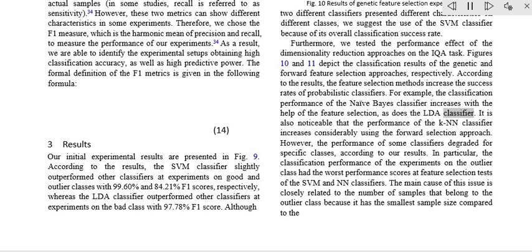Each image includes red dots that represent our OD and fovea detection results. Moreover, the EROD boundaries are presented in each image with red lines. Given that our approach depends on an accurate OD position, any image transformation related to the OD position will have a negative impact on our results. For example, the image frame of the DRIMDB failed sample includes an incomplete OD. Hence, our approach found the OD location incorrectly. In addition, our approach was unable to find the fovea.